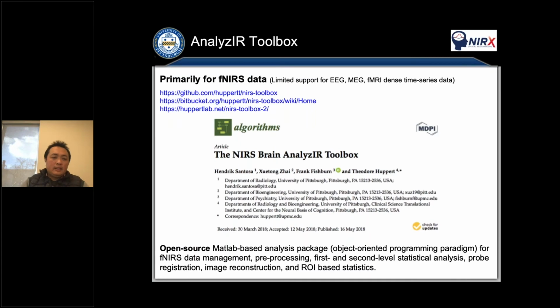So this is the toolbox. Right now I'm going to show how to use the NIRS toolbox for the short separation channels. You can read this paper if you want to know the details of this toolbox, and you can also download the scripts from here.